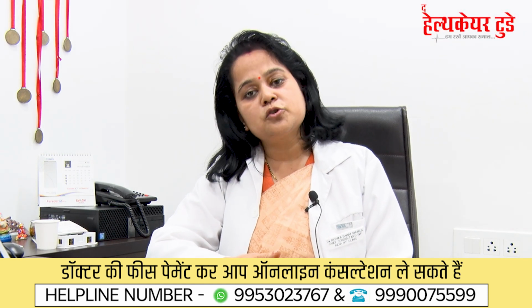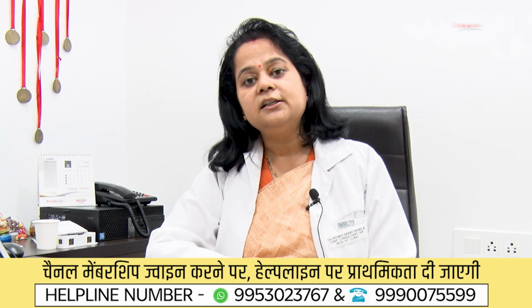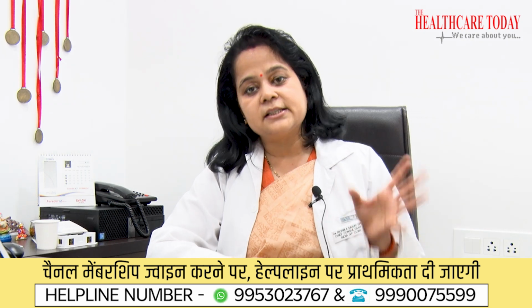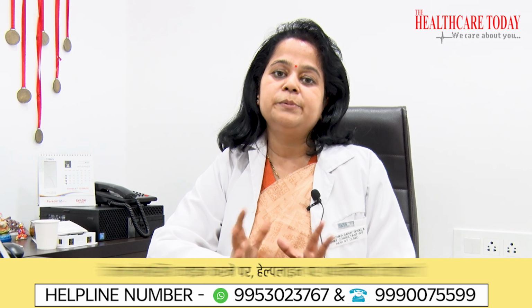And also we usually send the tissue for biopsy, and we can do different kinds of tests on that endometrial tissue that you need to understand. It's not only the biopsy or the TB test that is done. There are different comprehensive panels that are done when the hysteroscopy is clubbed.